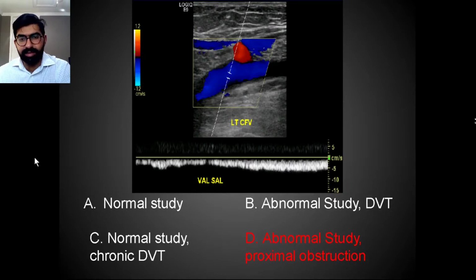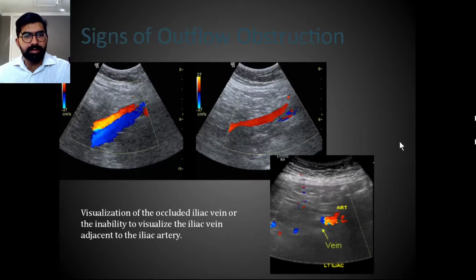Now, to get that liter back, normally during respiratory variation, you'll have some moments in a normal patient where you'll have more blood flow coming back and then less as intra-abdominal or intrathoracic pressure increases. But with the proximal obstruction, you're going to need the entire cardiac cycle to send blood flow back to the heart. And that's a good, easy way to remember the fact that someone with a proximal obstruction does have continuous flow in their veins. So let's move on.